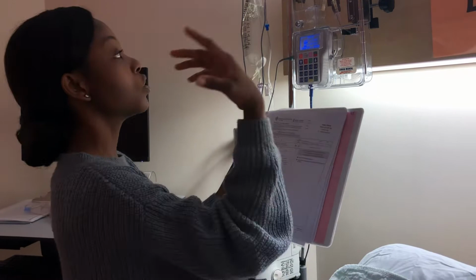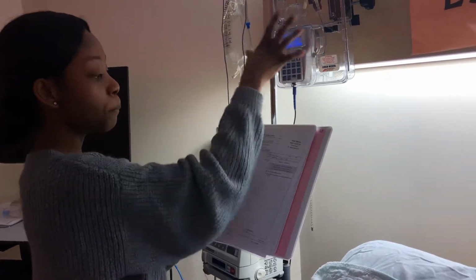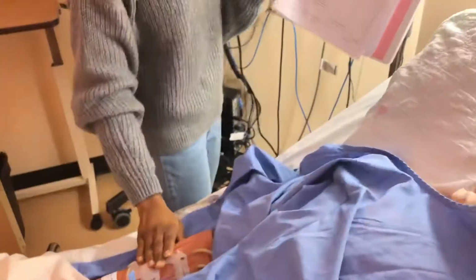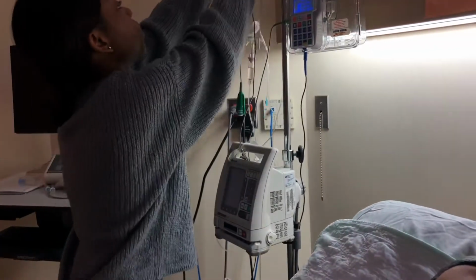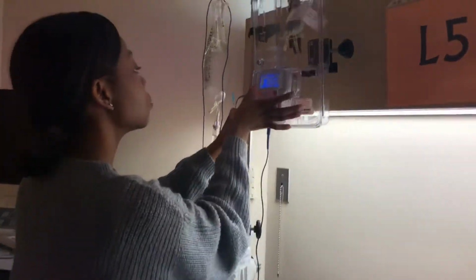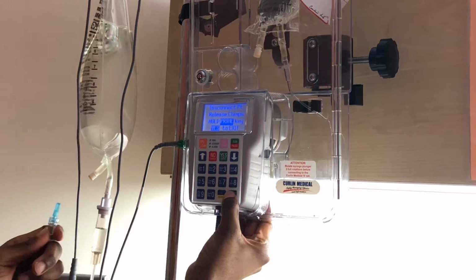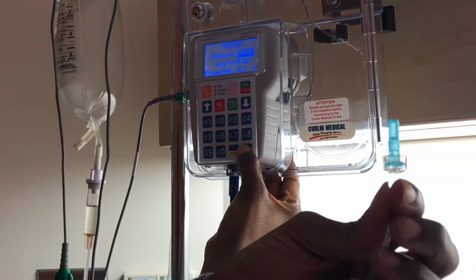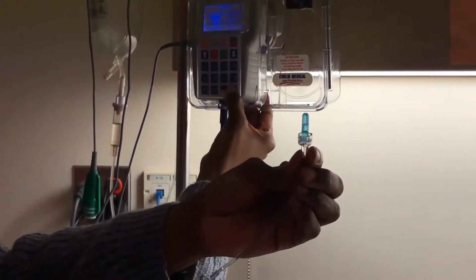So after I've done my second check, I'll call the nurse to do the third check. So she will do the third check with the bag, the pump, the order, and the patient's wristband. So now after I've done the 3 checks, I am going to prime the tubing. So run to start, no to review, now press prime. So I'm going to prime this, press hold to prime, until I see the bubble come up. Okay, so the bubble came up now.